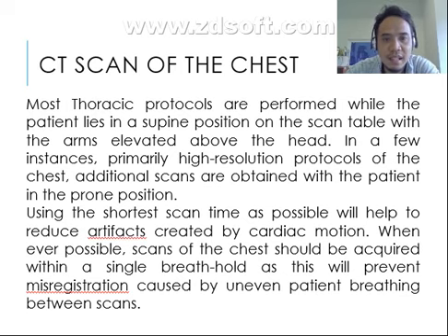Using the shortest scan time possible will help to reduce artifact created by cardiac motion. Whenever possible, scans of the chest should be acquired within a single breath hold, as this will prevent misregistration caused by uneven patient breathing between scans.